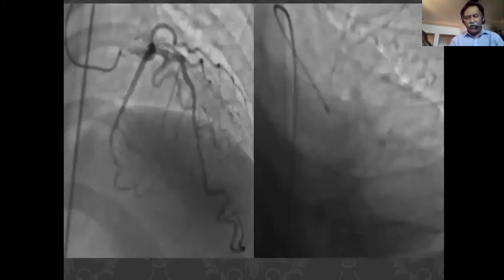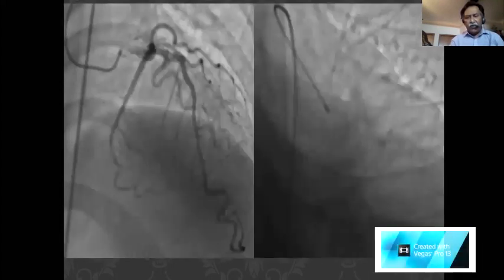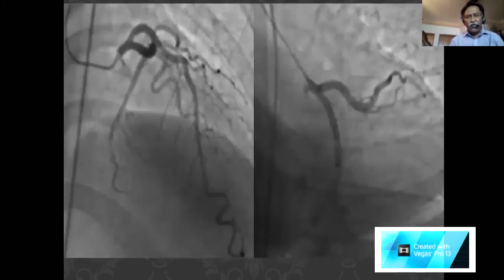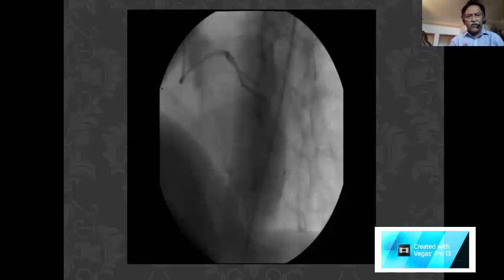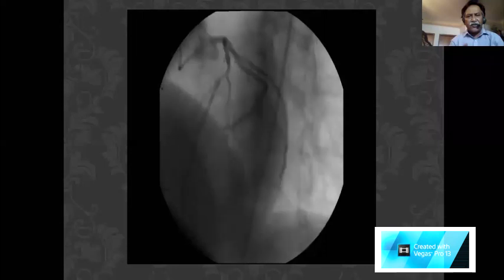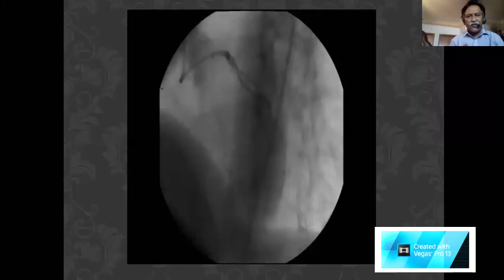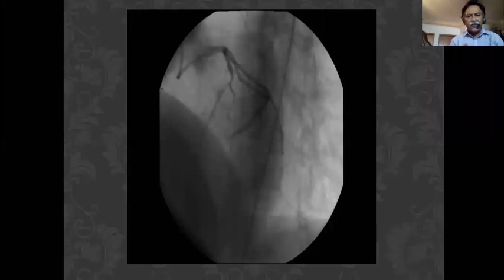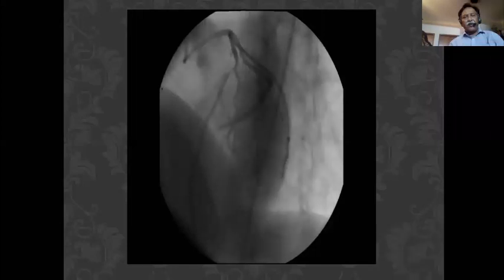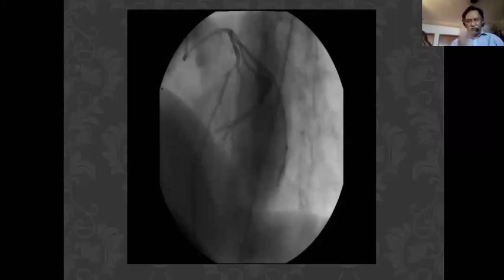So actually, what I have seen in this angiogram in my chamber, you see the catheter initiated the spasm or some form of air embolism that leads to this sort of scenario. Then I told the patient that you don't need anything, the medicine will be enough.